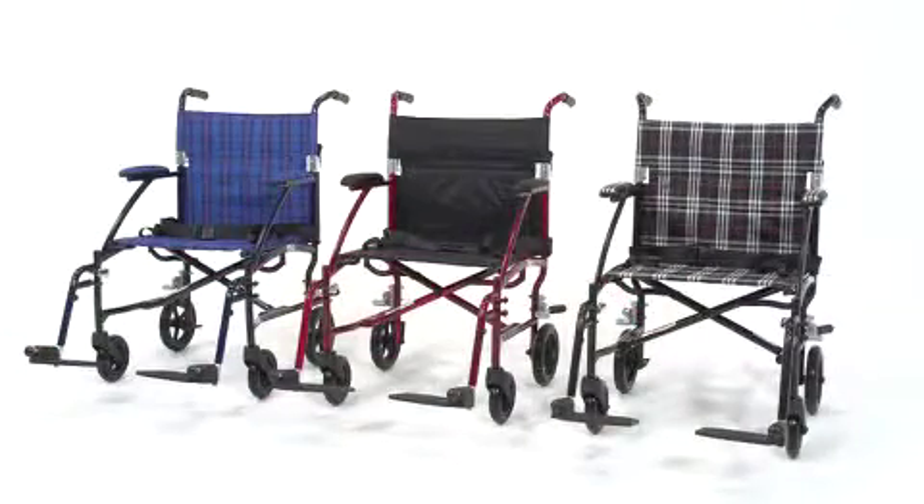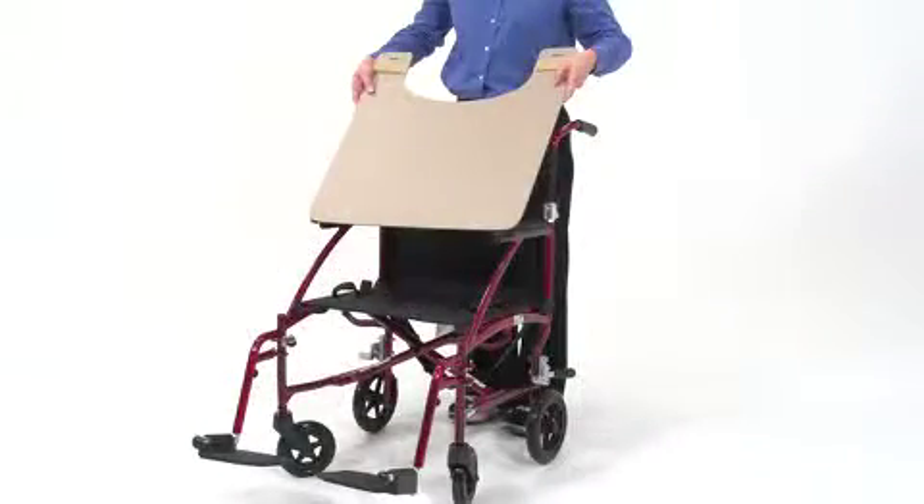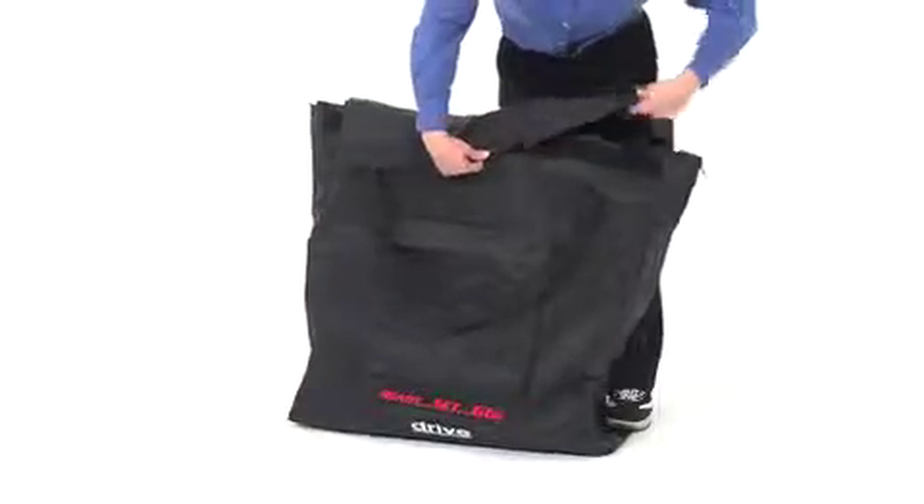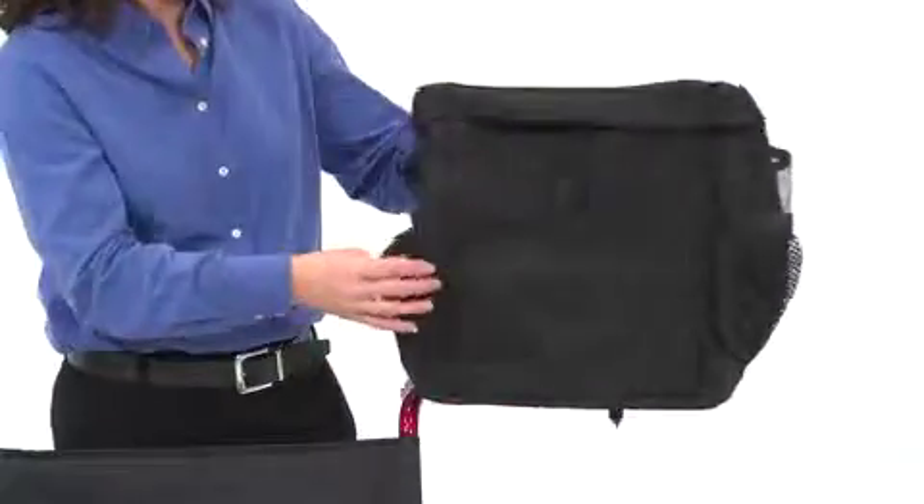The Fly Light Aluminum Transport Chair comes in three attractive color options. For added transport convenience, options for this wheelchair include a tray, elevated leg rests, a carry bag to store your folded chair, an attachable carry pouch to store your belongings, and a bag for oxygen tanks.